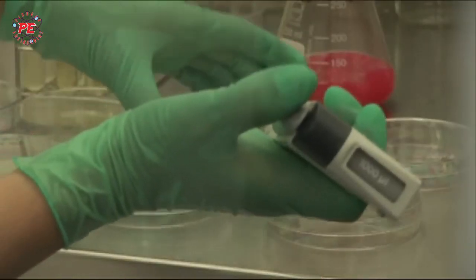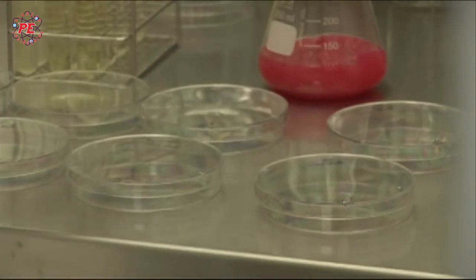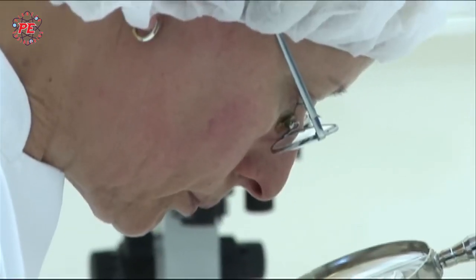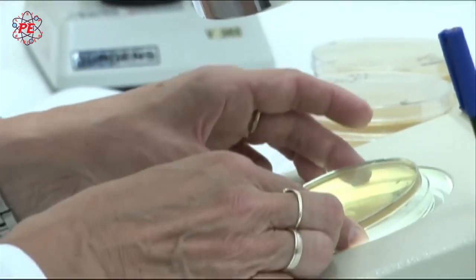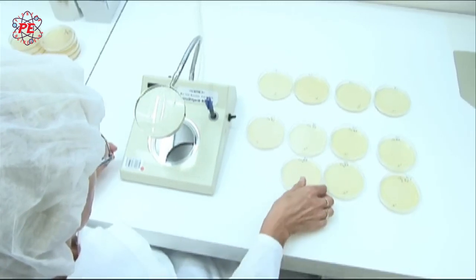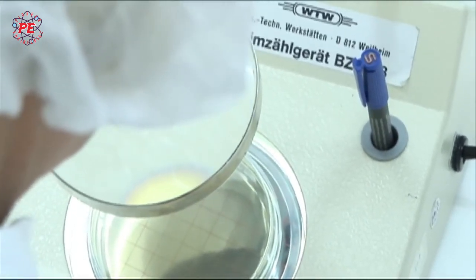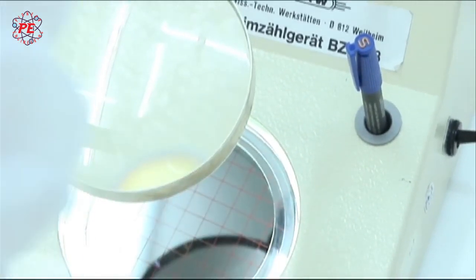The next inspection is cleanliness, in additional examinations involving volunteers who are the target of inspection. This examination is to ensure that the condom is microbiologically clean. Under sterile conditions, the condom is cut and dipped in a sterile solution. This solution is then filtered under a vacuum and then checked for germs that may have been transmitted. This extra check is documented by the DLF quality seal printed on every single condom package.